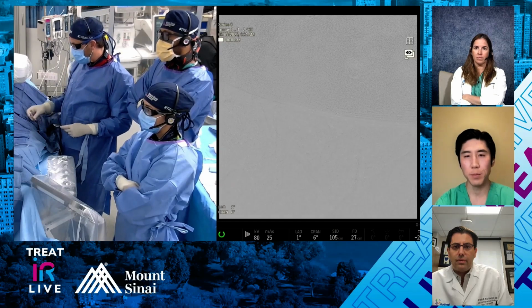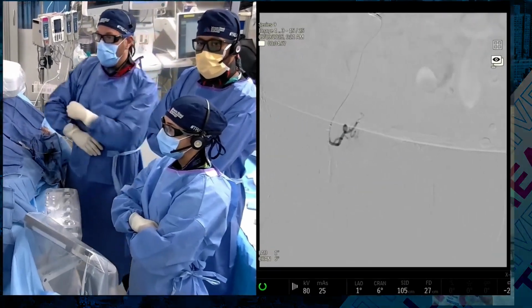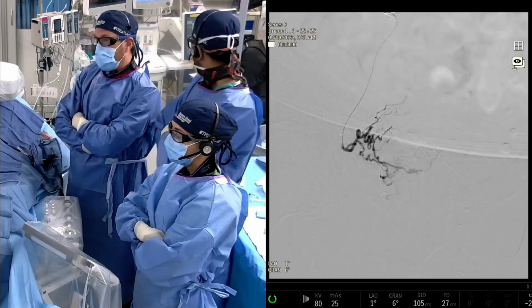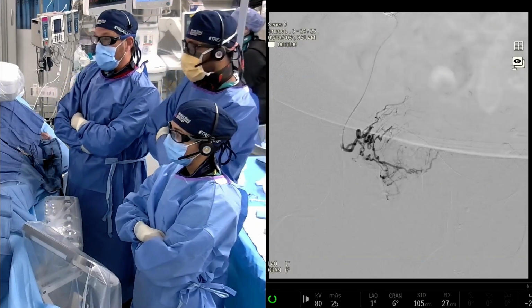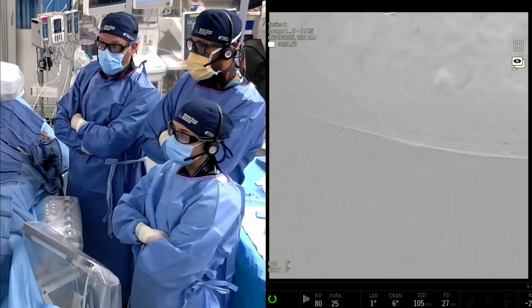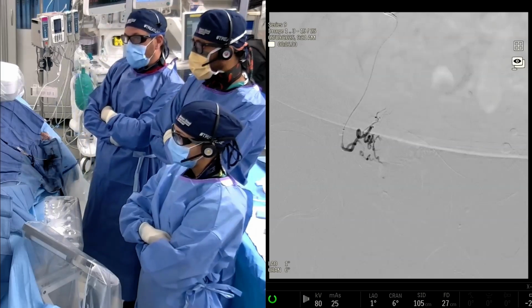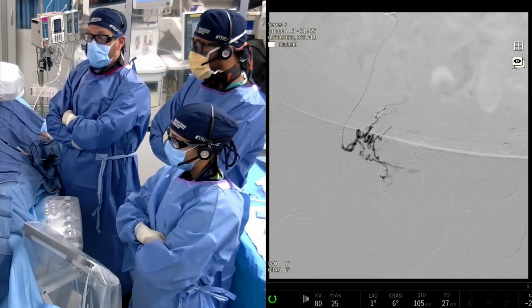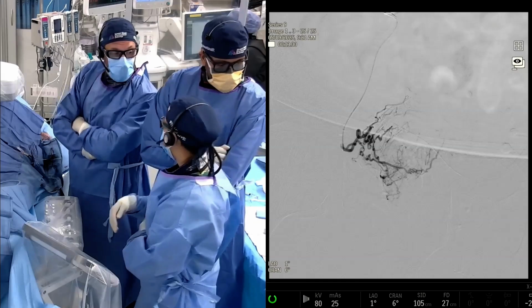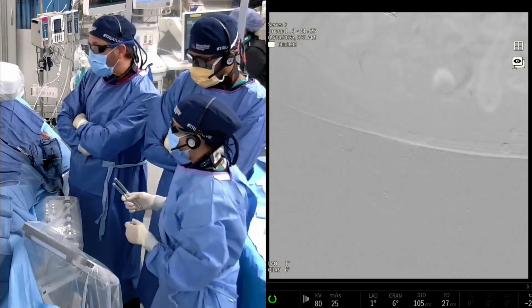Yeah. So you guys saw the balloon going up. We put a very small amount of 50-50 into that balloon, and you can see very clearly there's flow almost completely redirected to the prostate with no flow down to that other branch. So I think we're very comfortable embolizing from here. We've already mixed up our embolic. You guys use this as well. So this is a 10-to-1 dilution, which we're gonna grab from the side table. Let's grab one or two syringes of the liquid embolic and then one of the water.